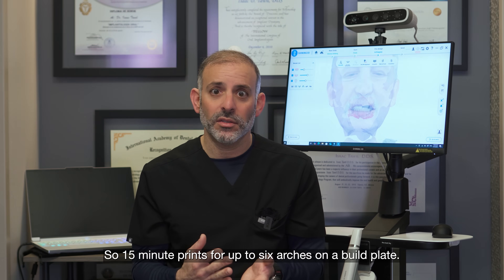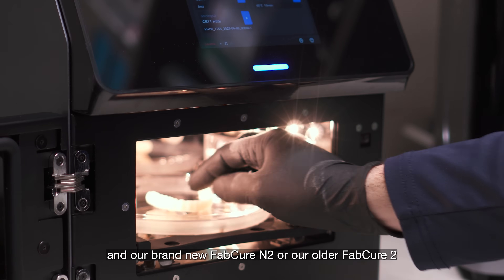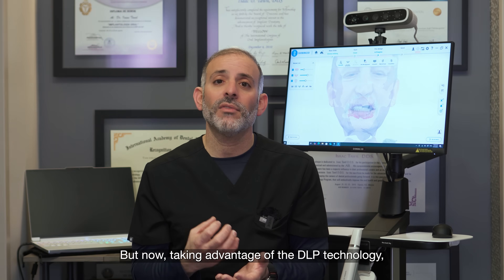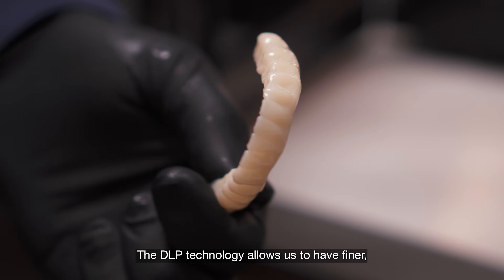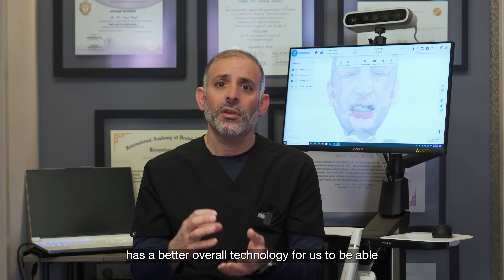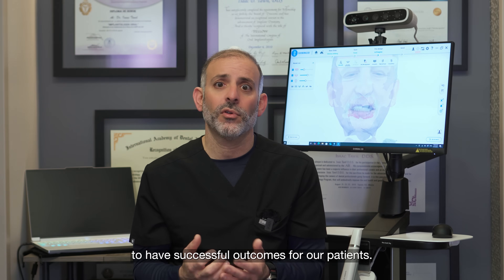That enables us to achieve the same print times as the LCD printer — 15-minute prints for up to six arches on a build plate — still utilizing our AcuFab Wash and our brand new N2 Cure or our older FabCure for same-day dentistry, but now taking advantage of DLP technology. DLP allows finer, more accurate, more consistent printing because of its stronger light source and better overall technology for consistent, successful outcomes for patients.